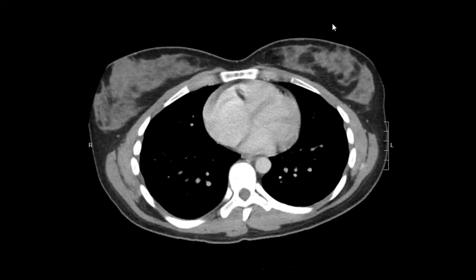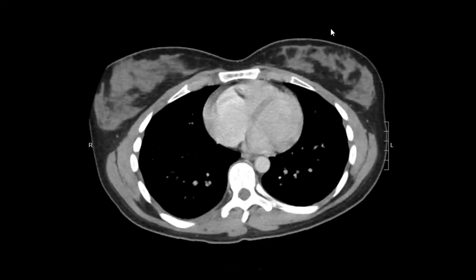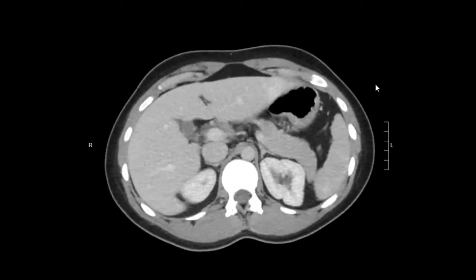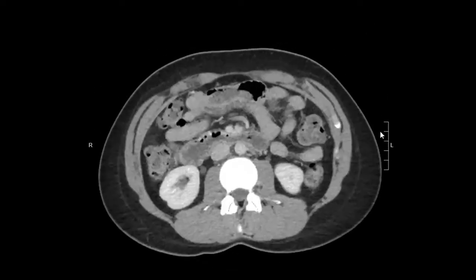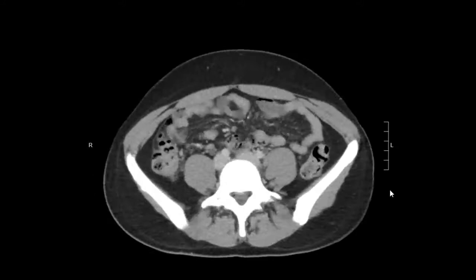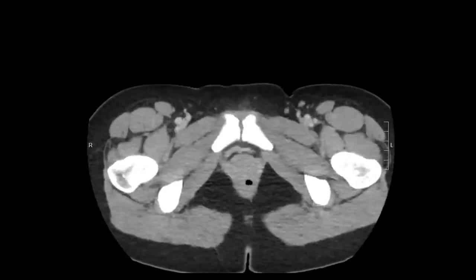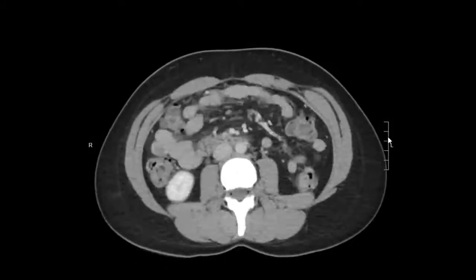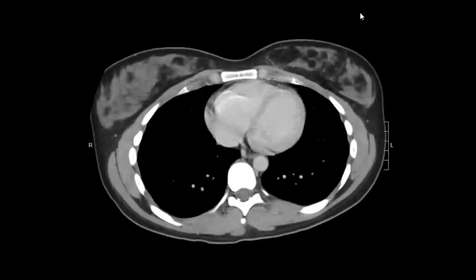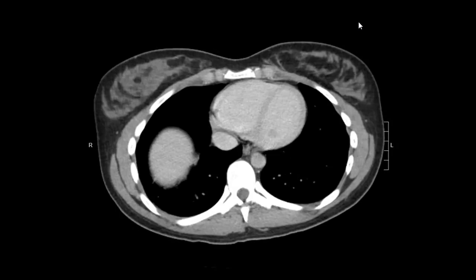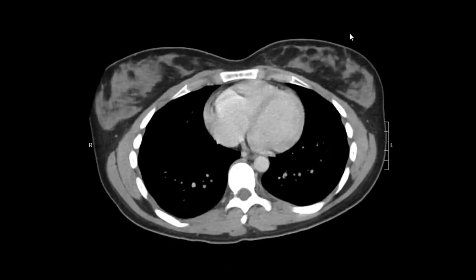So we're going to go ahead and start. The first thing I do is take a quick scan through the exam, and then I go ahead and actually start looking at the individual organs. I start off by looking at the solid organs first.